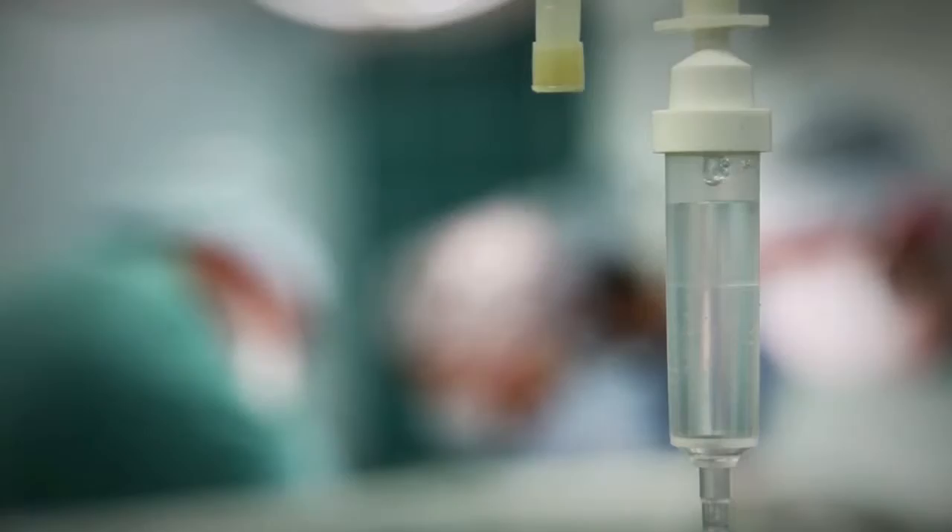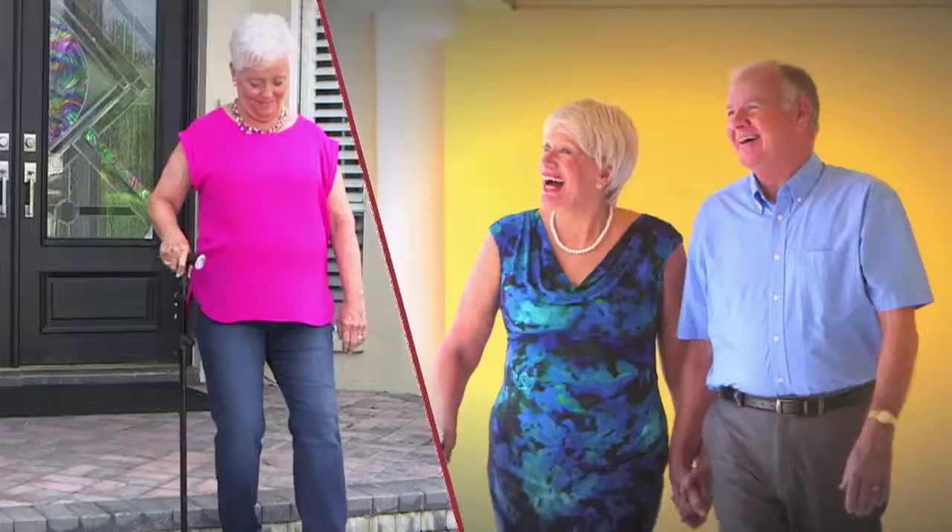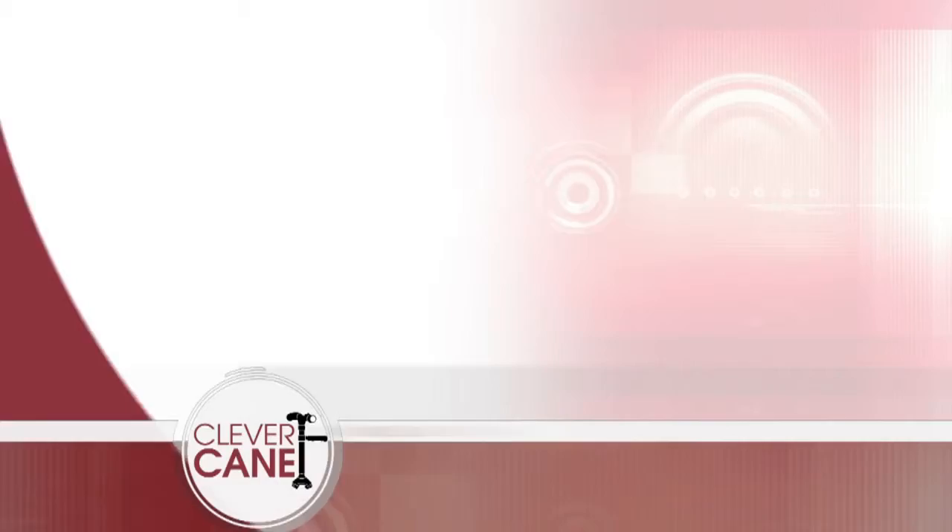What would happen if you fell? A broken hip? Months of surgery and recovery? Thousands of dollars in medical costs and lost wages? Do you want to own a cane that gives twice the support of other canes? Get back your independence and enjoy life again, and not have to rely on others for those simple everyday tasks. Get your very own Clever Cane today for only $39.99.